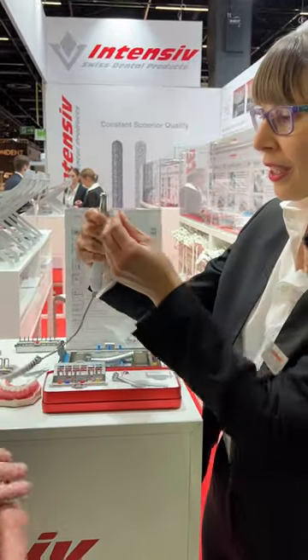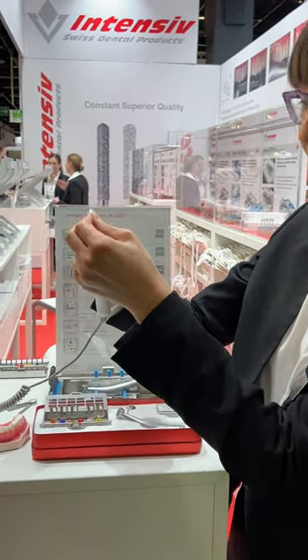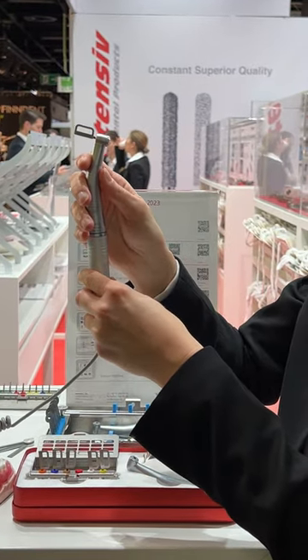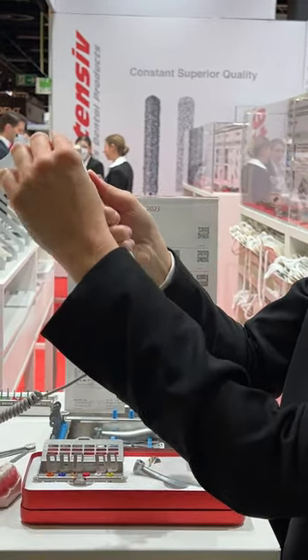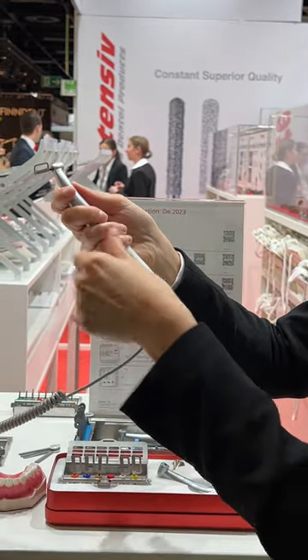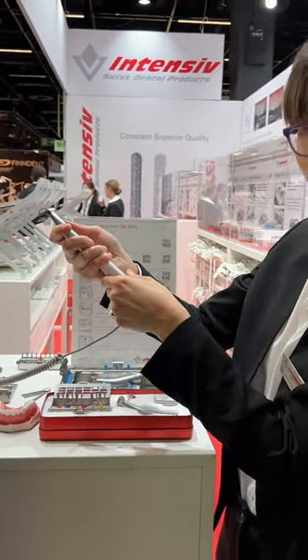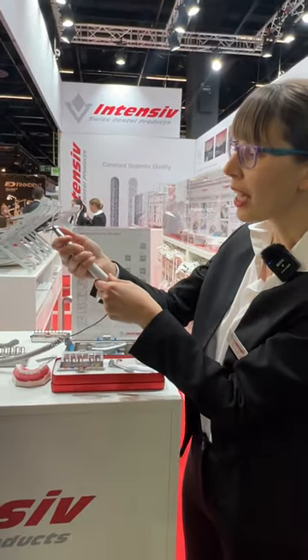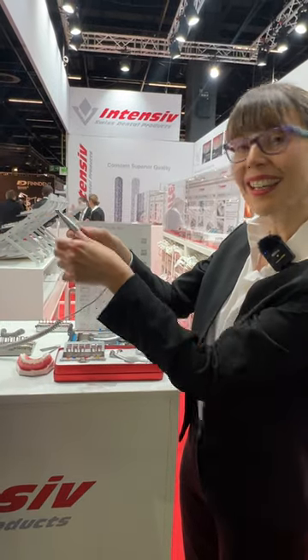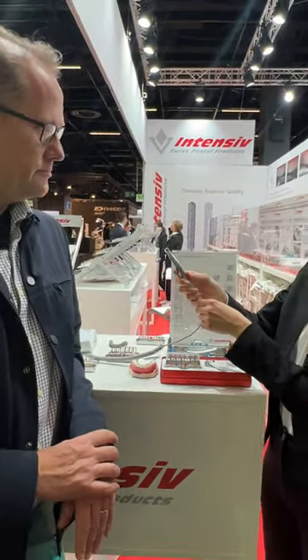The intensive swingle has a unique feature: when you place the strip inside — these are intensive orthostrips — you can have two possible modes of working. The first mode is the free rotation mode, which helps the doctor choose the exact position for the IPR work. Then you can block it using the switch at the back, and it's possible to proceed with the work in a very precise and calibrated way.